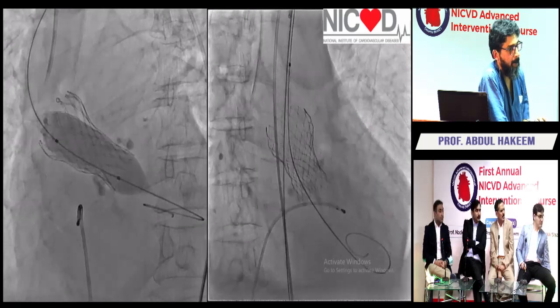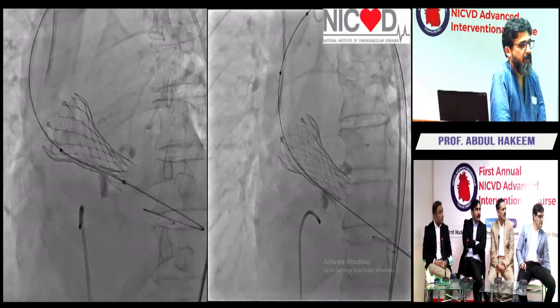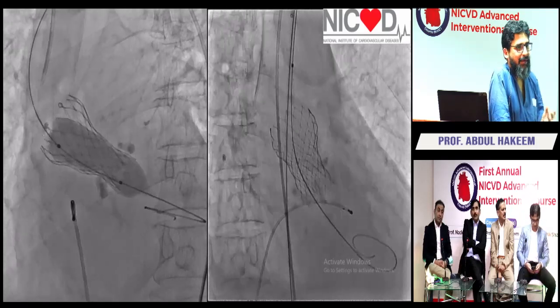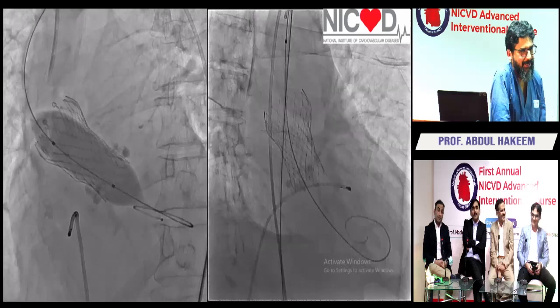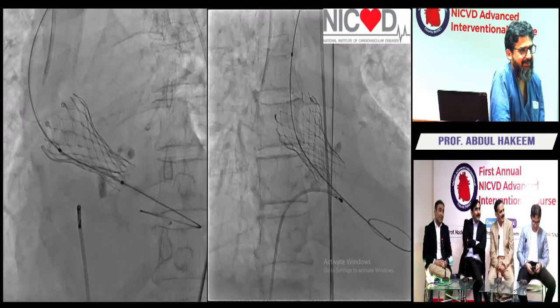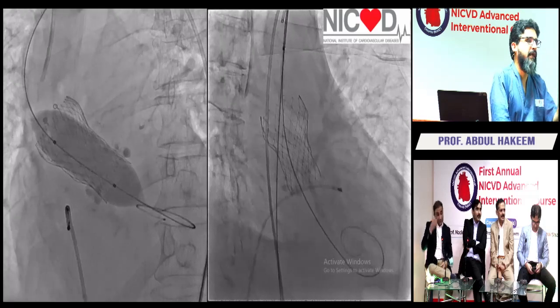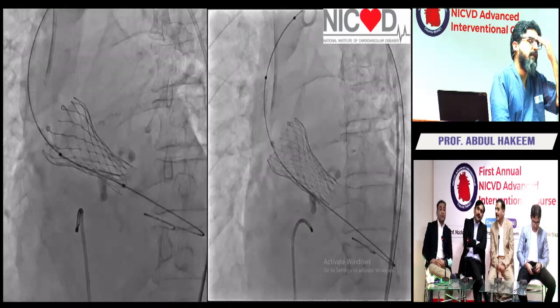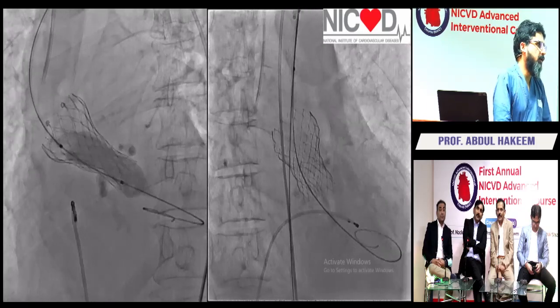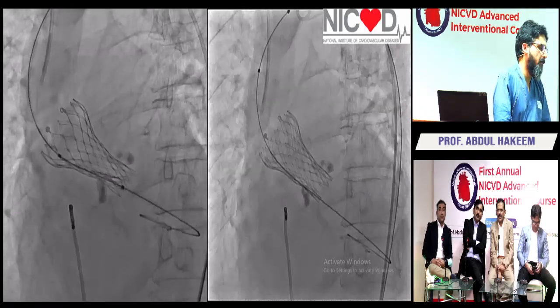Sir, I want to comment here. It's a CoreValve. Can we place another valve with the less advantage, like an Edwards Sapien valve here? Dude, if we had Edwards Sapien, we would not be using CoreValve. No, not here. I'm just asking. Yeah, you're right. So yes, that is the standard way of doing it. So if you embolize an Evolut, you would want to put in a Sapien.